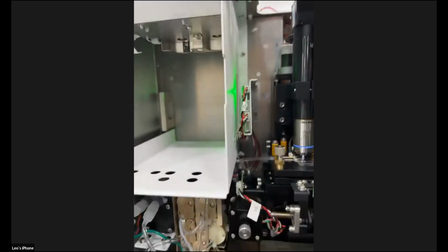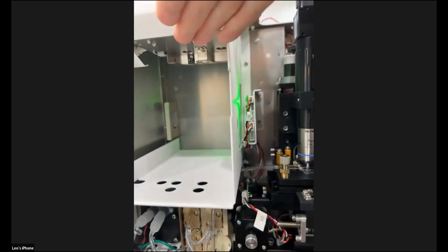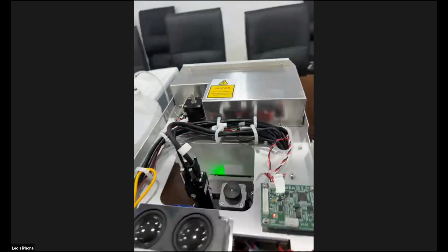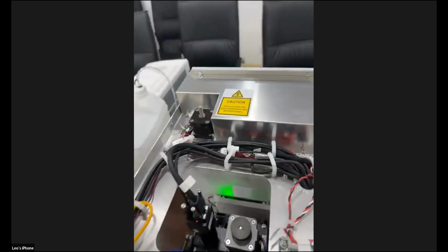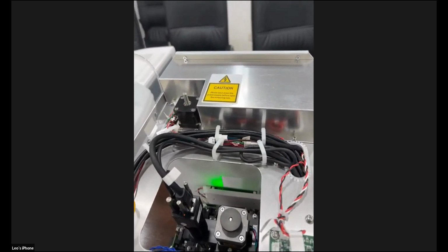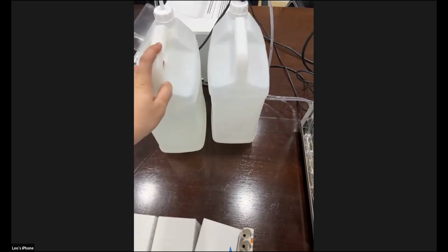This motor is to keep that, there's a special connector that will be moved down, and then it will be connected to the reagent, to the inner package reagent. But for your machine, there's no this function. You only have the outlet reagent.